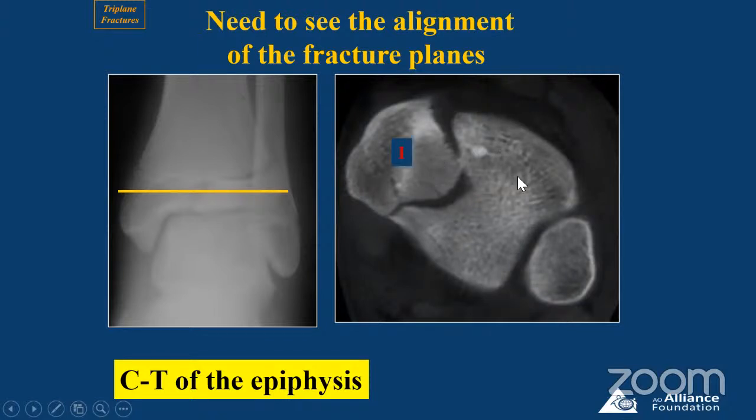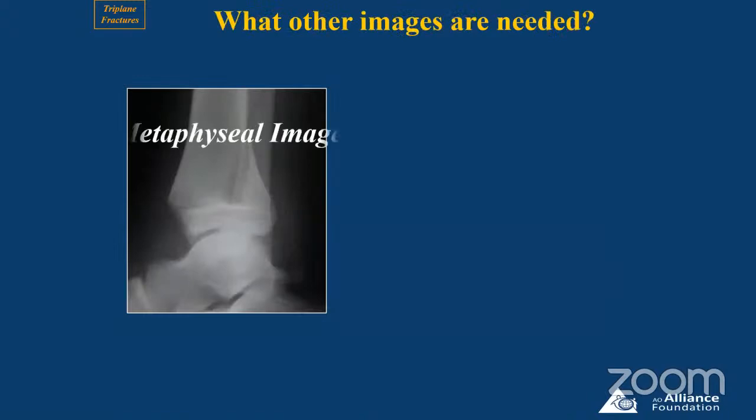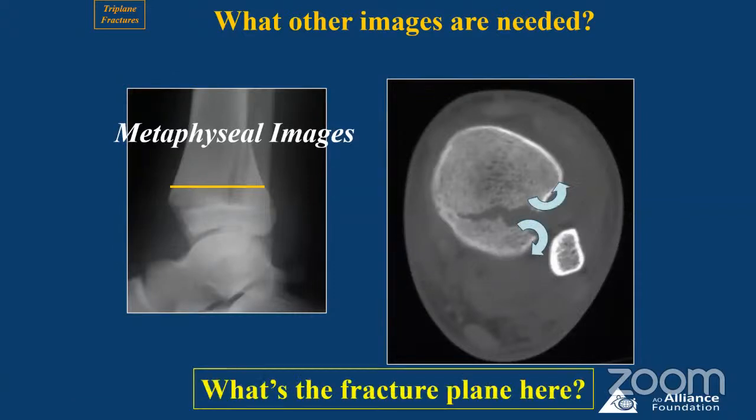The same fracture, when you take a cut from the metaphysis, okay, what do you see? So this is in the sagittal plane. Okay, that is the epiphyseal fracture. If you take a cut from the metaphysis on a CT, what do you see? The plane has changed. This is now in the coronal plane. Okay, so this is how it is displaced. It's the same fracture, just going upwards. The plane here is in the coronal plane.